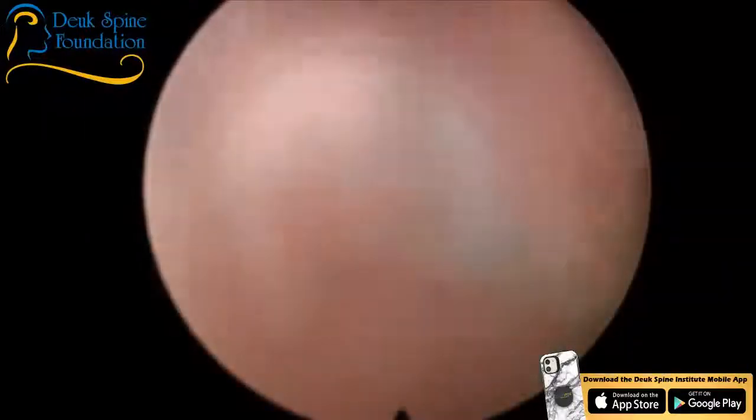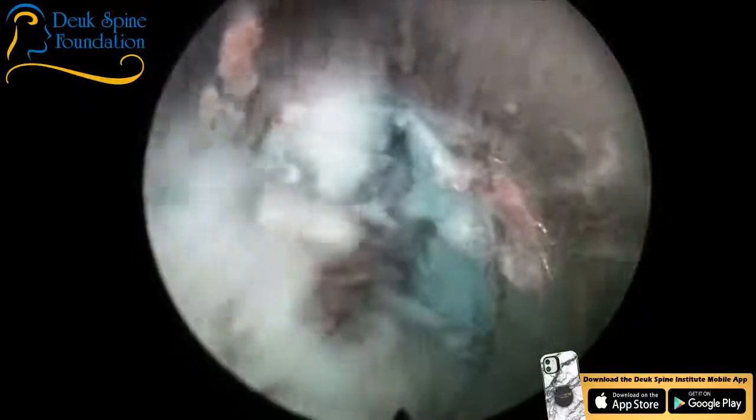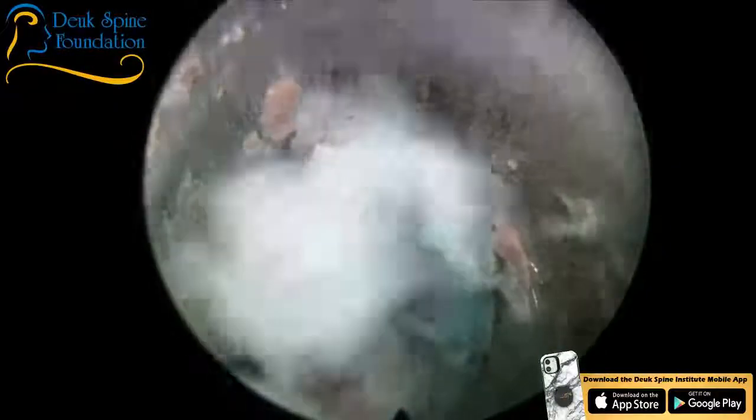How are we doing, folks? Good? All right, so now we're going to go into the disc. I'm advancing the endoscope, and there's the end of the tubular retractor, and there I've shoved some of the herniation down into the middle of the disc. We're going to use a laser and a grabber to remove these pieces of herniation.